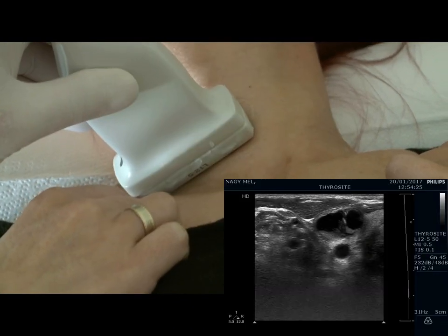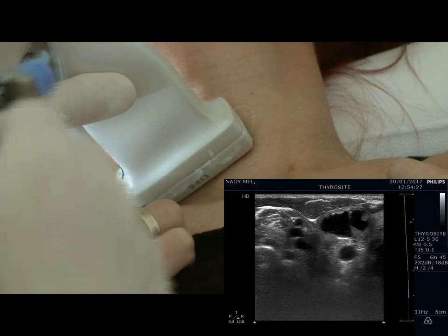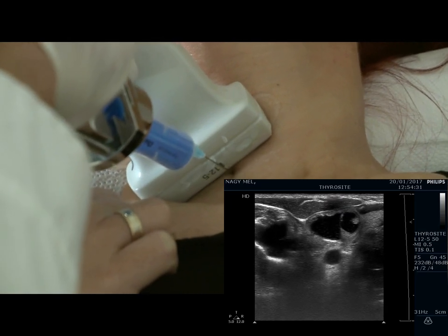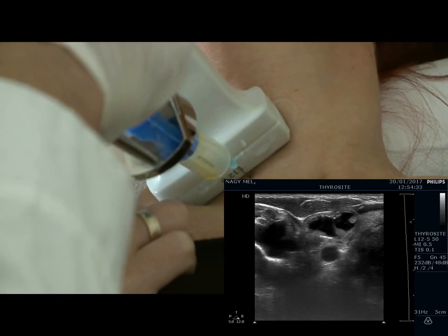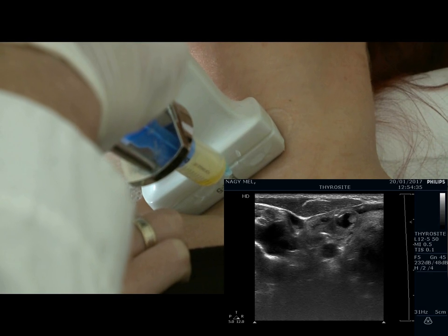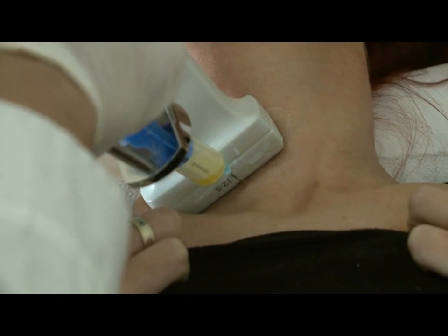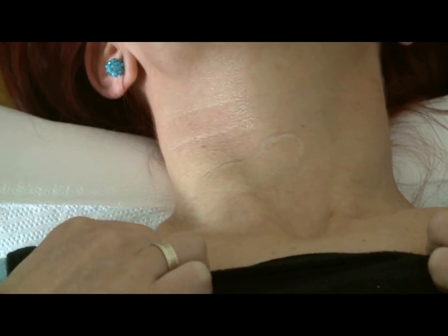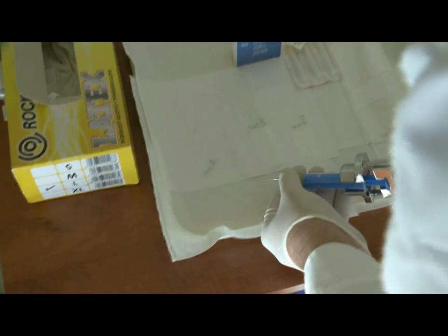The first technique of ultrasound guided aspiration is the perpendicular one. The nodule is positioned in the middle of the screen while the needle is positioned centrally just over the nodule. We aspirated 1.5 ml of yellow fluid. Now we prepare the smear.